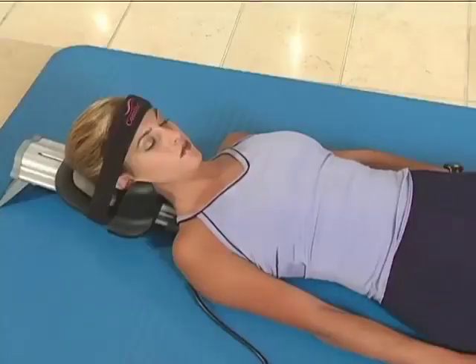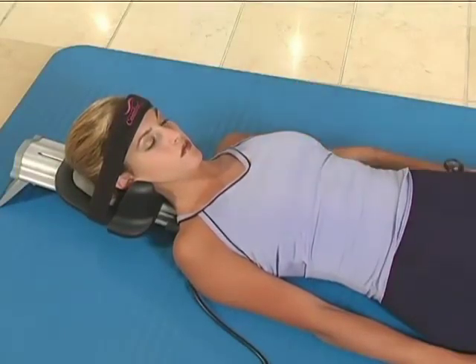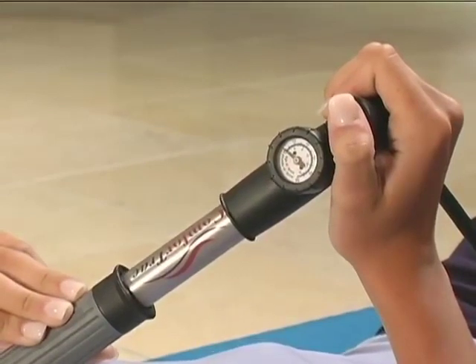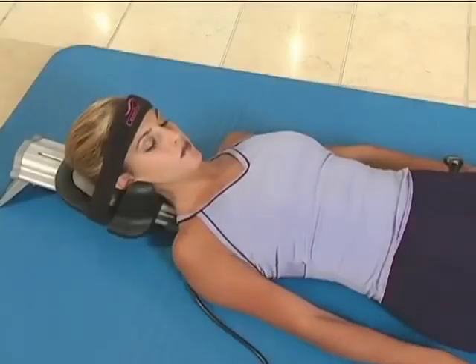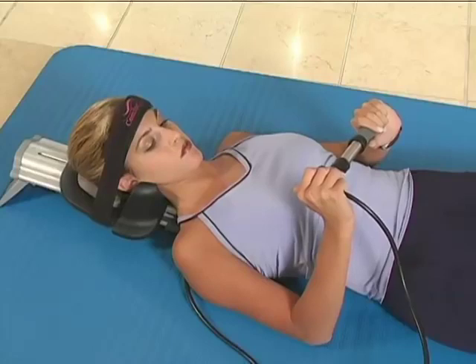After you have reached your recommended traction force, begin timing your treatment as prescribed by your healthcare provider. Be sure to lie still and relax during your treatment time. In case of an emergency, fully depress and hold the release button until traction is in the neutral position. After the traction is complete, press the release button to reset the traction back to the neutral position.